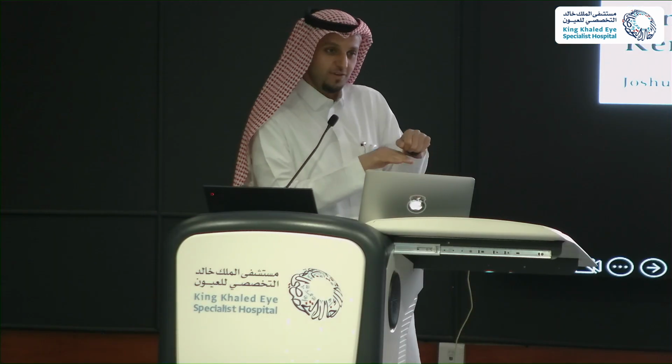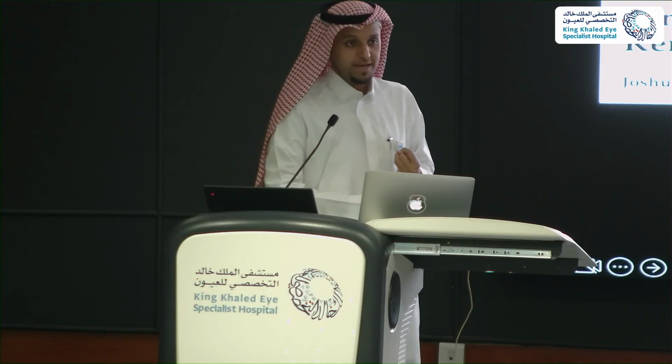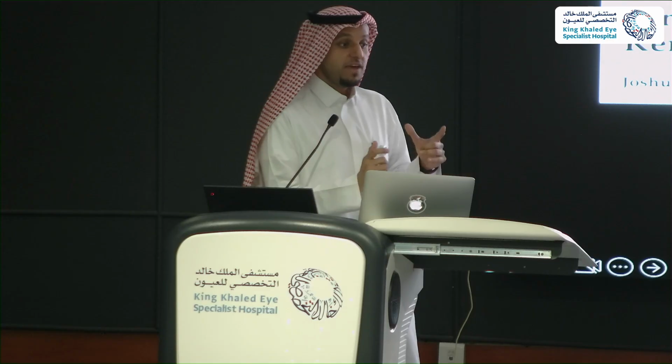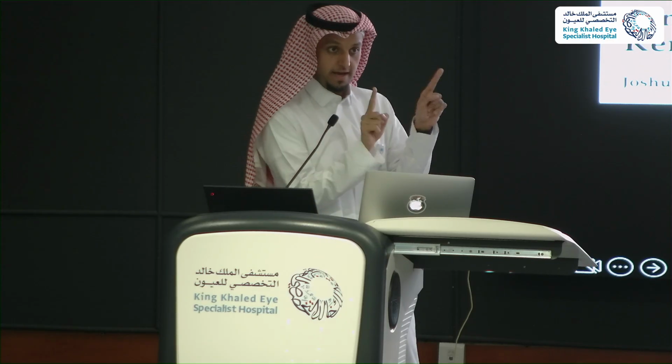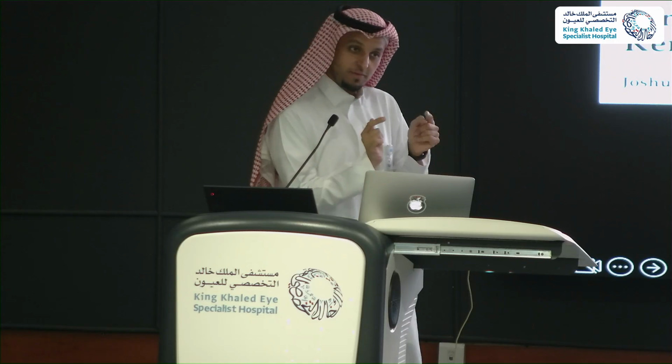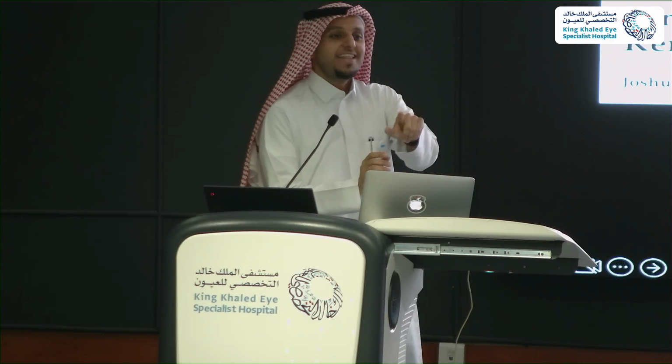But with manual, you're doing, first of all, Dr. Umar, you're an amazing surgeon. That's one. That's a fact. Second thing, if you want to achieve the mushroom shape manually, and you want to reach deep, and you want to do big bubble, I think it will take 4 hours. That's one. I'm not aiming for this. Just give me a second.